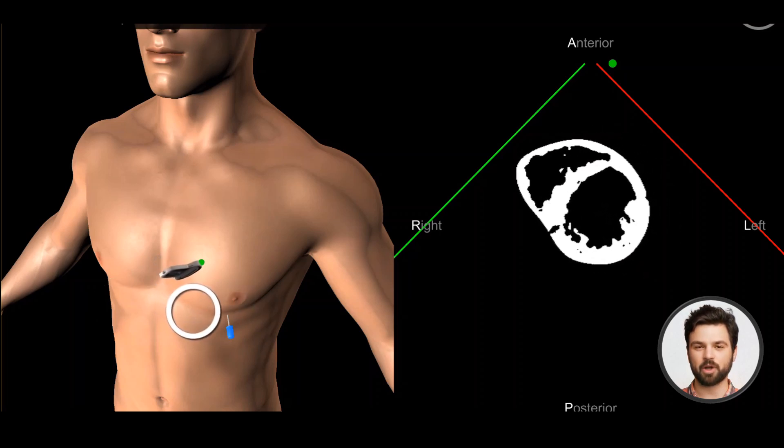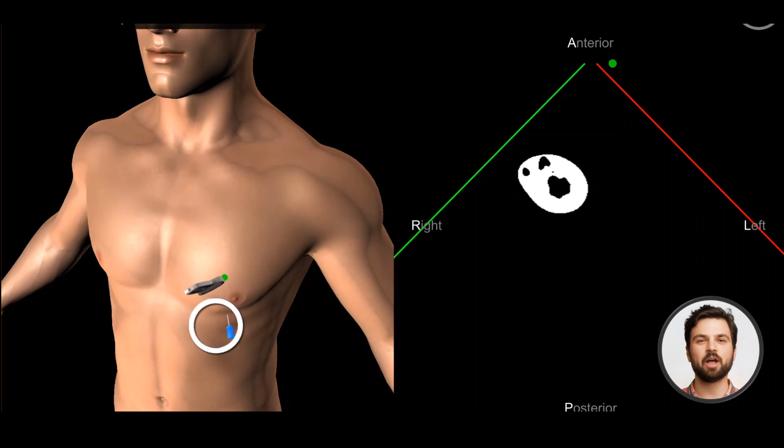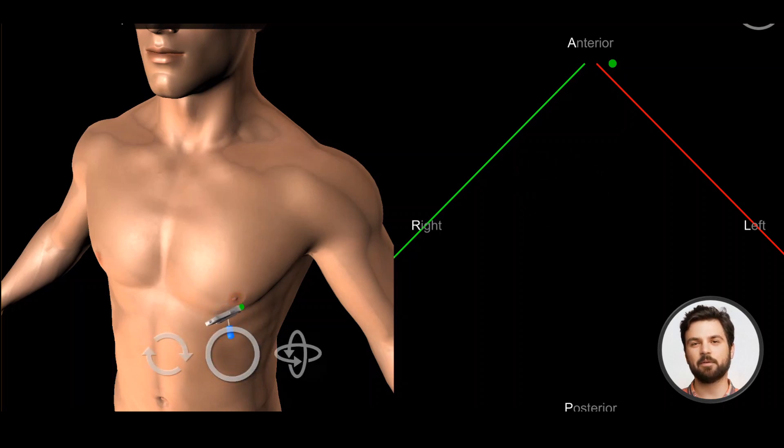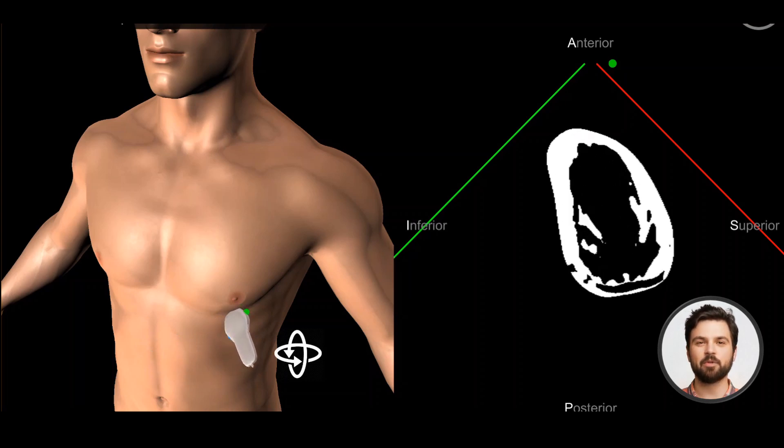Slide the probe over the chest wall until you reach the apex of the heart. This is the point of maximal cardiac impulse. The apex is normally located over the 4th or 5th intercostal space in the mid-clavicular line.